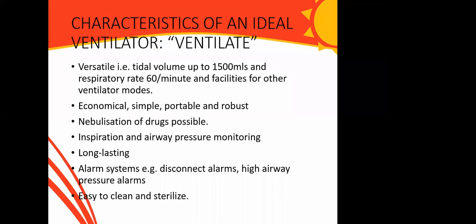It should be economical. It's something that you want to be able to maintain with minimal support from outside. It should be simple, portable, and robust. Portable, because a lot of times you may need to use the ventilator to transport your patient.